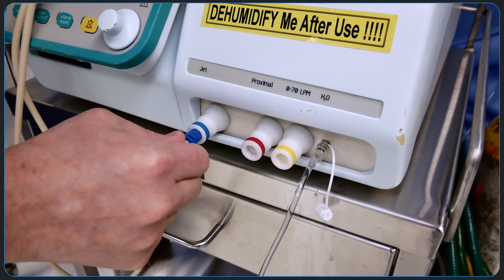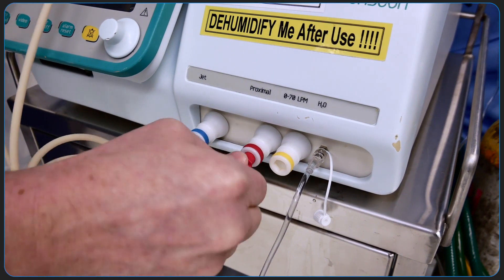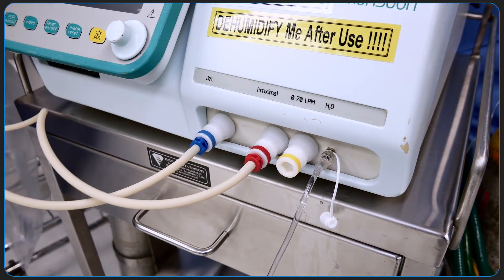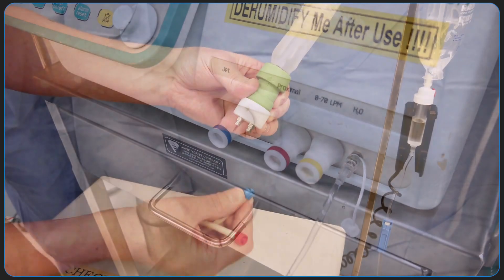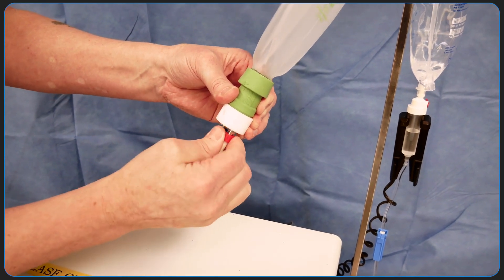Now connect the patient tube and pressure sensing tubes — blue to blue and red to red — at the front of the ventilator. It's important to hear a click when connecting the tubes. To disconnect, press the connecting portion inward to release the tubing. Connect the other ends to one of the two lower lock connections on the test lung.